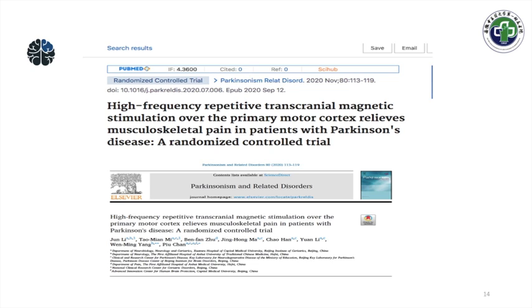But our study also has several limitations that should be noted. First, in the present study, we applied a traditional but commonly used protocol by orienting the coil 90 degrees as the sham strategy. Second, we did not rule out depression and anxiety patients in our study. Emotional factors affect the interpretation of the primary outcome. However, as over 90% of patients with PD have comorbid depression, excluding emotional factors completely might lead to selection sample bias.